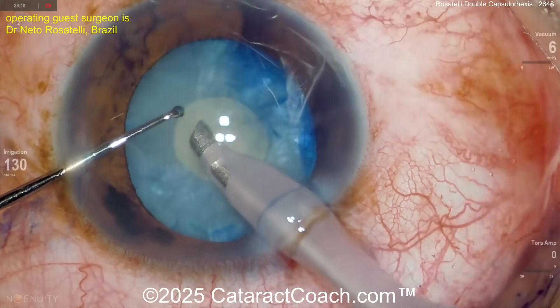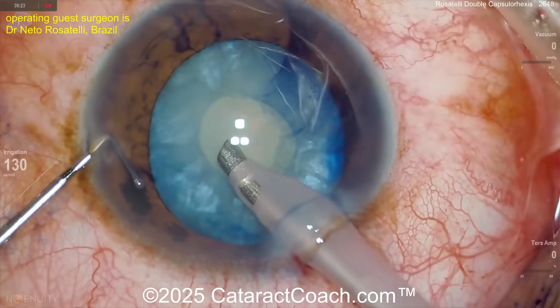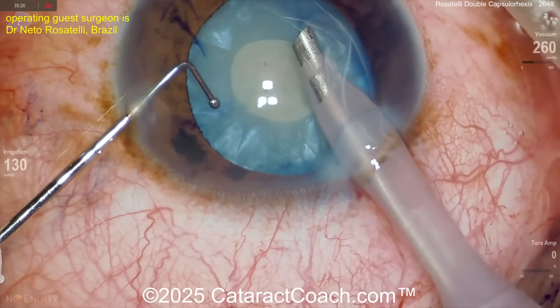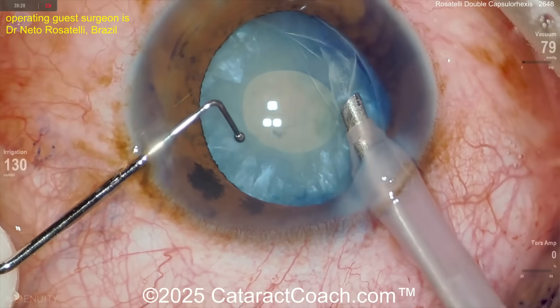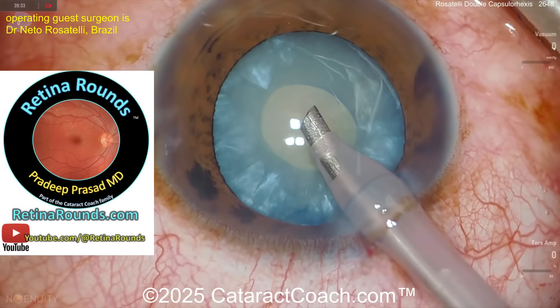Now once you've done that, you can enlarge the rhexis. Again rotating this lens and then getting that milk out again, tapping on it, tilting it side to side to make sure you get out the liquefied lens cortex that's behind the nucleus too.